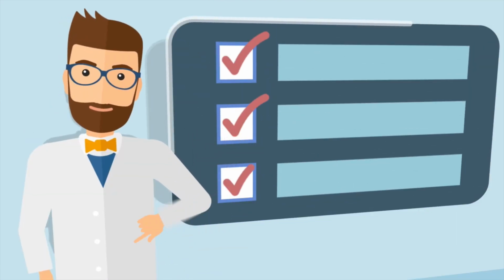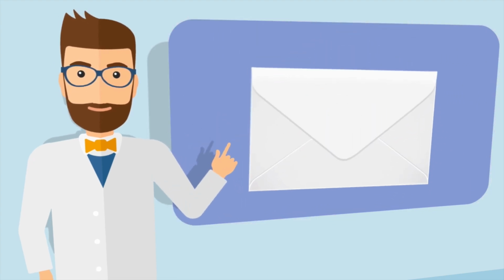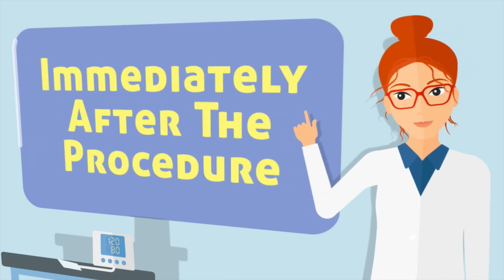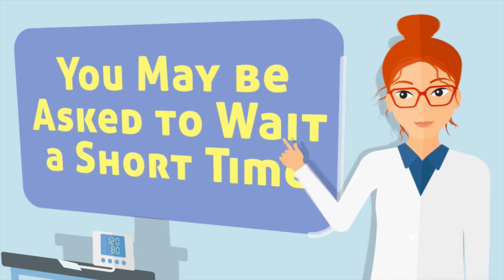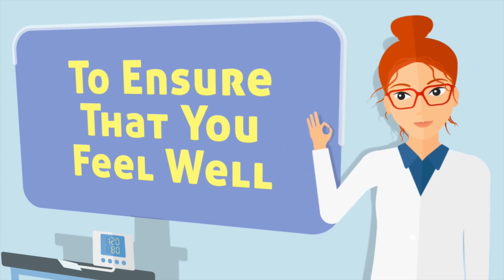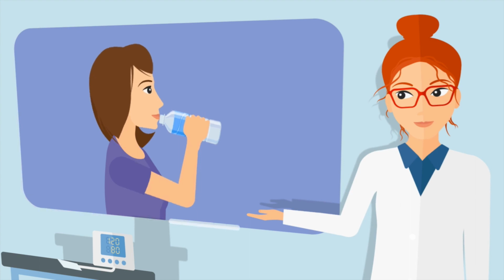If there are any specific instructions you need to follow before the kind of CT scan you are having, these will be sent to you prior to your appointment. You can resume your normal activities immediately after the procedure. If you are given contrast, you may receive special instructions. In some cases, you might be asked to wait for a short period before leaving, to ensure that you feel well after.